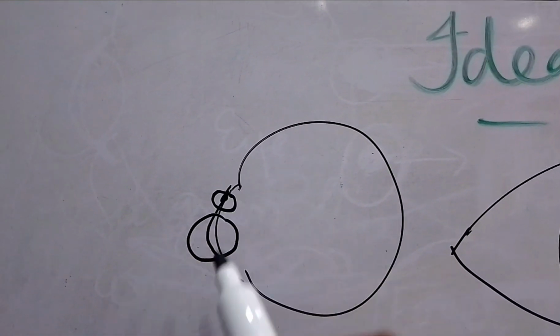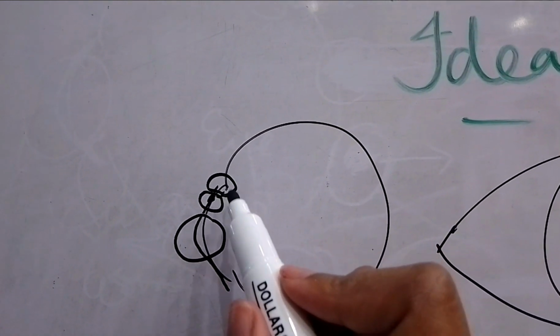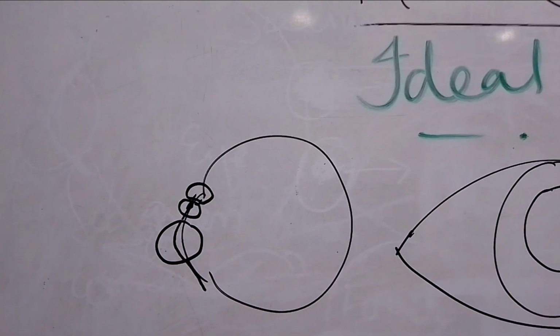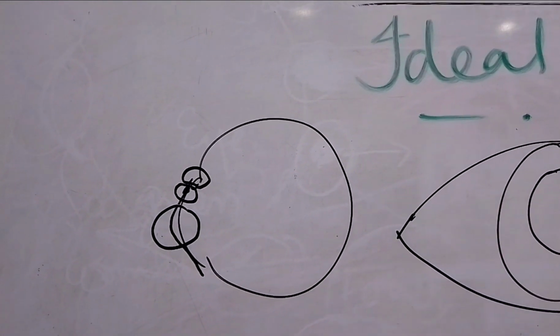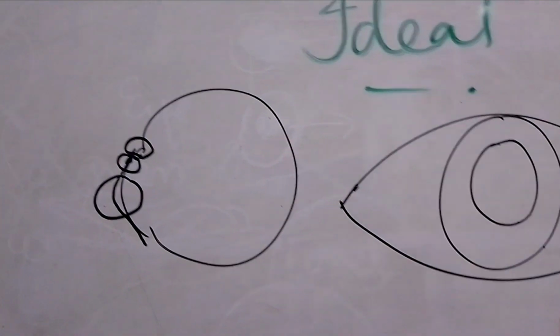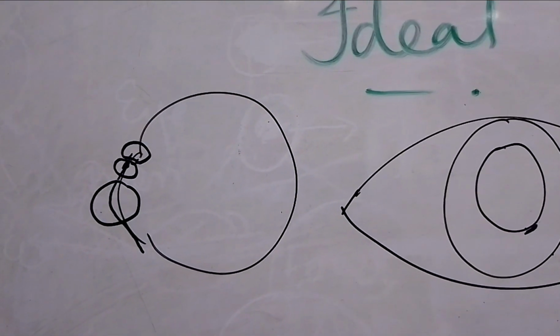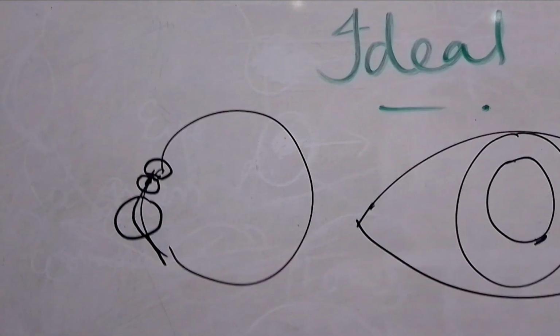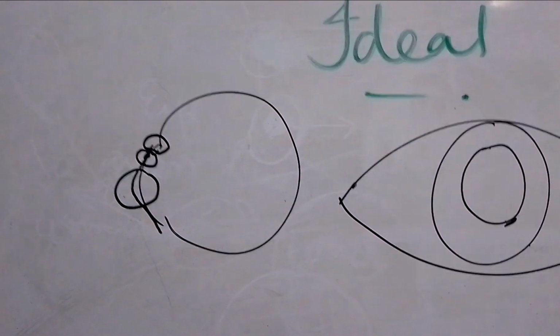There will be a touch at mid periphery, and there will again be no touch in the peripheral region or at the edge because of the tear exchange, so that there may be adequate tear exchange between them. The edges should not be in touch with the cornea. That is the reason whenever the patient blinks, the contact lens will move upward, and while it moves upward, the edges allow the whole contact lens to have the tear exchange. Okay, so due to this consistent tear exchange, the edges are not in touch with the cornea.